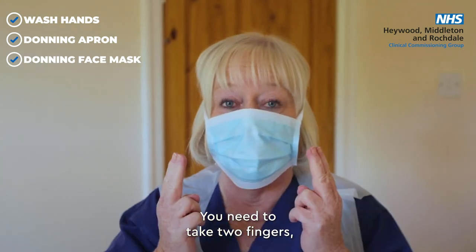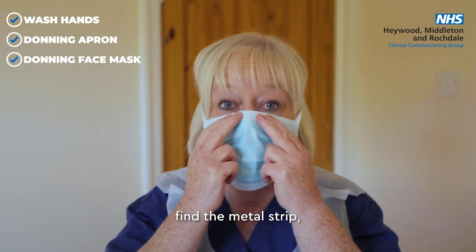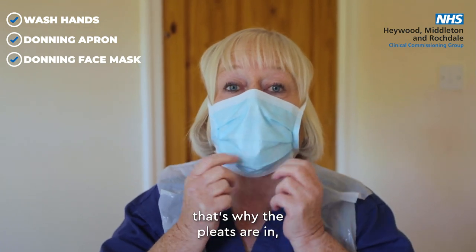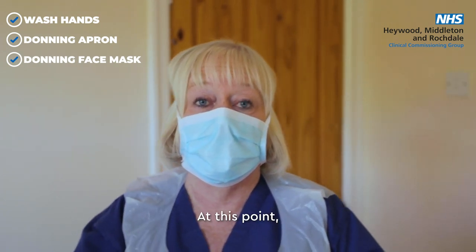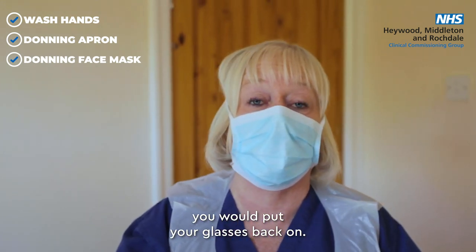Take two fingers and place them at either side of your nose, find the metal strip and press it down to make a snug fitting — do the same with the chin area. That's why the pleats are in, so it can fit snugly underneath your chin and feel quite secure. If you're a glasses wearer, you would put your glasses back on at this point.